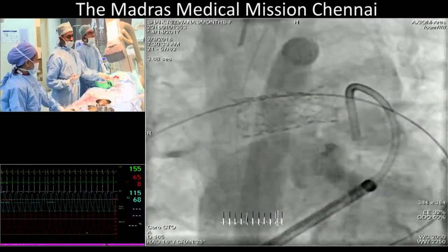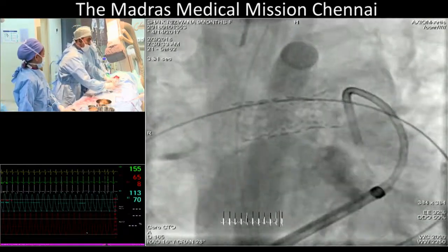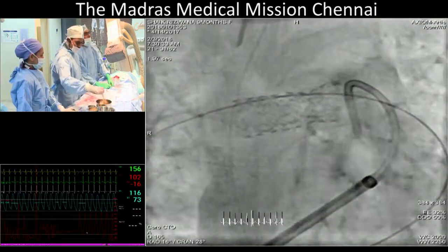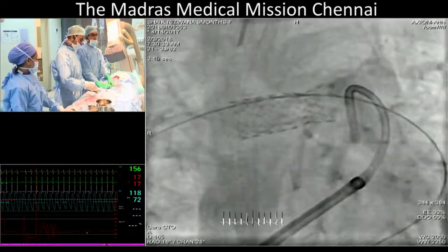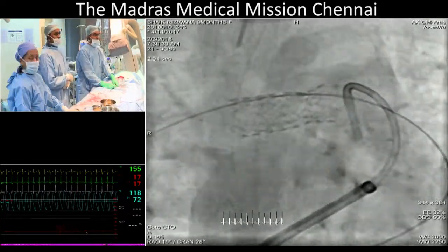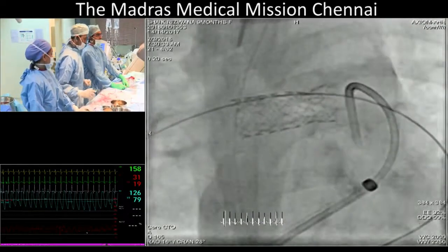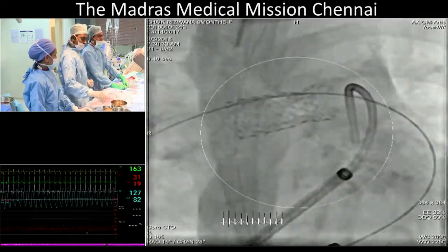Shaq, as I was mentioning earlier, I will now show you the pressure in the post-hilar LPA. Go to LPA picture. LAO, go to LAO. See, this is the left. Can you see that? It's around 30 systolic. Okay. And the RV. So what are you thinking about the left?